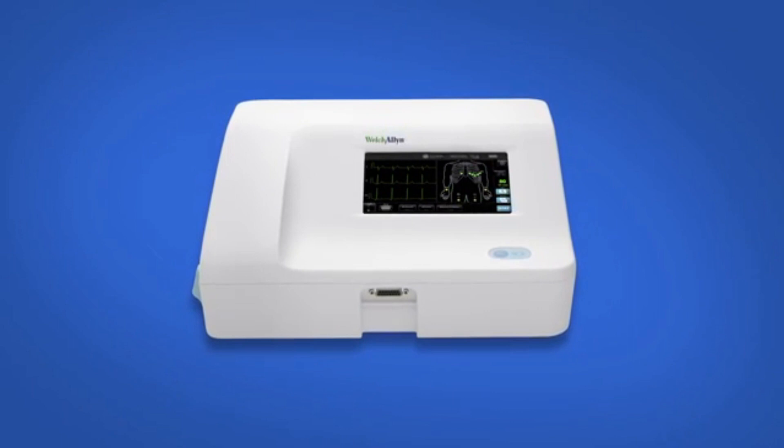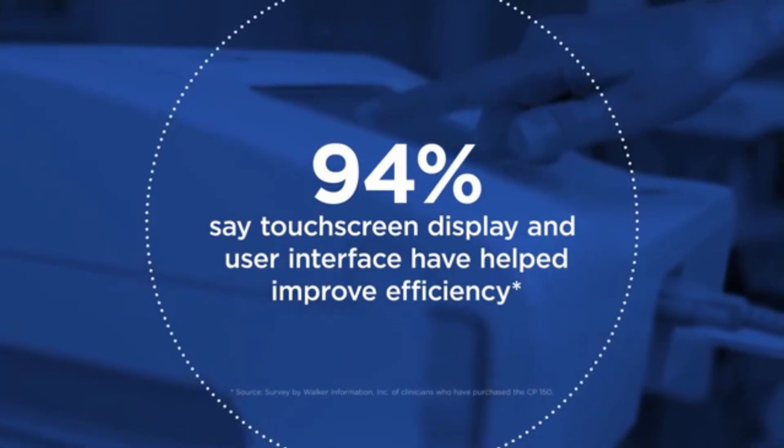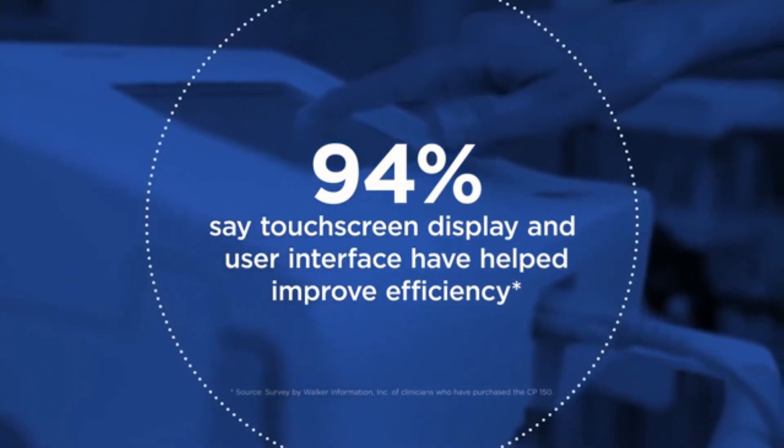Let's familiarize ourselves with the unit. The CP150 has a very simple layout with a touchscreen interface that is modern and intuitive. In fact, 94 percent of users surveyed say the touchscreen display and simple user interface have helped them improve practice efficiency.